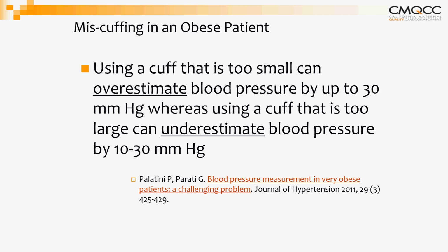And again, using a cuff on a patient that's obese can alter the blood pressure, overestimating by 30 millimeters of mercury, and that's huge in terms of how that's being managed. So it's really important that we consider, if we don't already have those on our unit, and depending on our patient population, that we may need to consider getting some new cuffs in to be able to adapt to those populations.